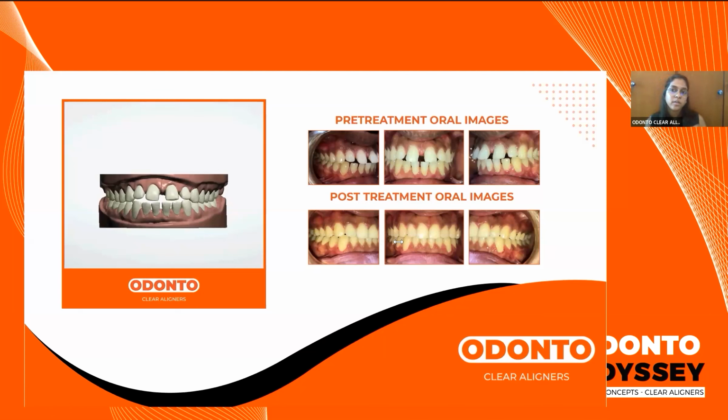If we try to fabricate the retainer based on the first scan or impressions that you sent to us, the bonded retainer which you will have placed is not part of your initial scans. This will come in the way and the retainer is not going to fit on top of it, which is why you need to first bond your retainer once you're satisfied with the treatment outcome. After that, you will have to take a new scan or new impression and send that across, on which we will fabricate the retainer and have it sent over to you.